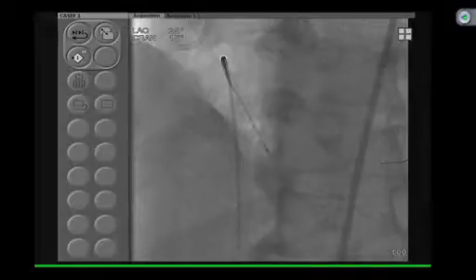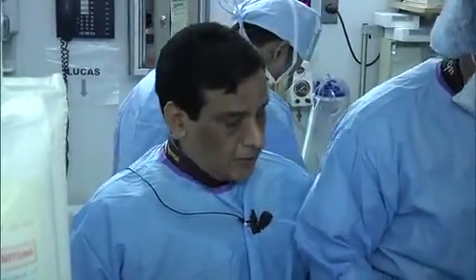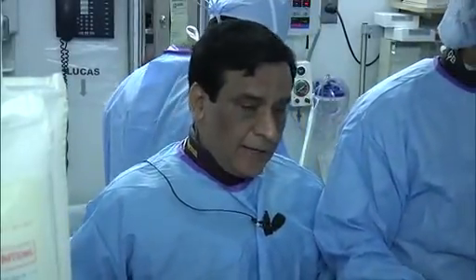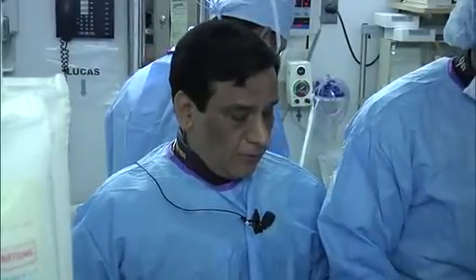There are some data from the PEPCAD studies which have shown that maybe the DES is still better in those cases. So the drug coated balloon, if you are not planning to do another DES, is a very reasonable alternative. And knowing that the drug coated balloon is not available in the United States right now, they just have started the trials of Lutonix in the peripheries, and of course ultimately it will go down to coronaries later on.